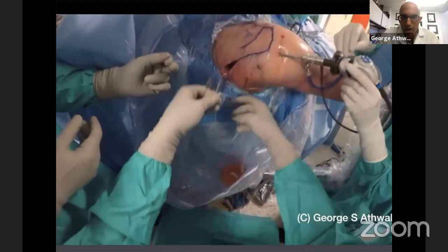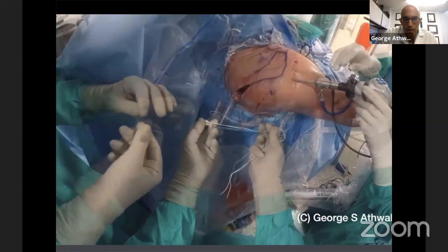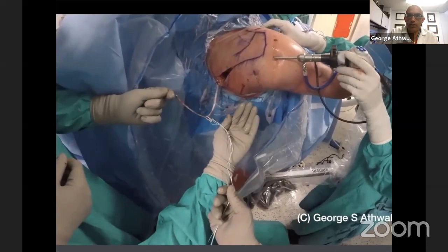So now here is gonna be my fixation apparatus. I'm gonna use a cortical button and I'm gonna do a suspension double loop reconstruction, or doubling up of the graft. I'll show you here. So there is the cortical button and there is the loop. I'm going to pass my semitendinosus graft through the loop. So what you can see is I have my graft, the loop, the cortical button, the sutures for the cortical button, and then my suture shuttle. So one long train. And so then Christy in the front, she's going to pull on the suture shuttle.